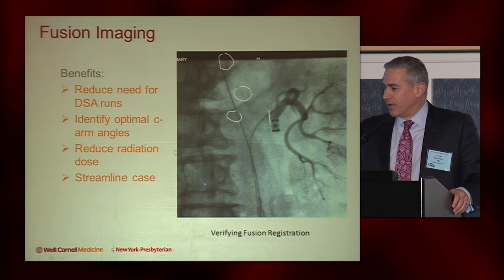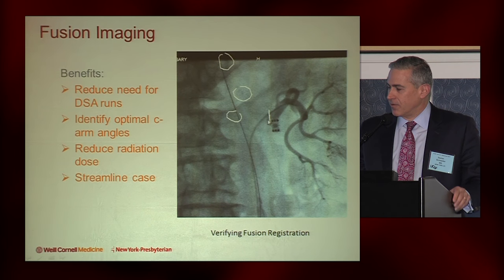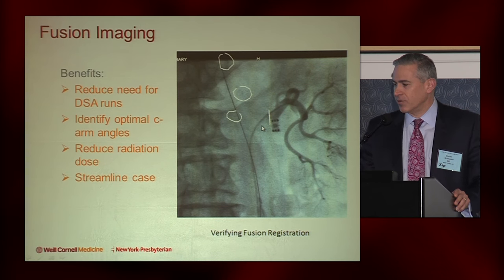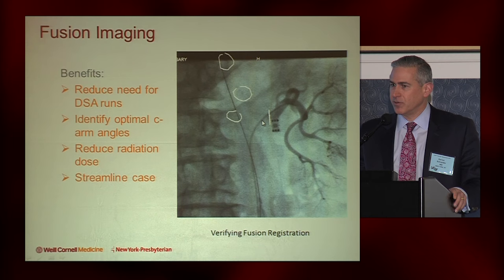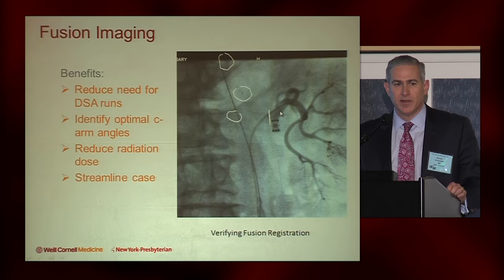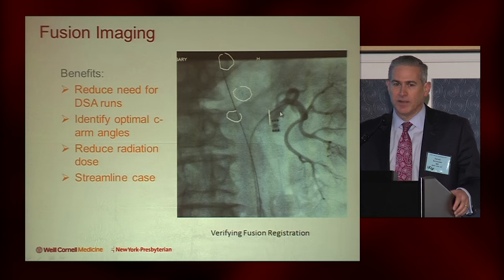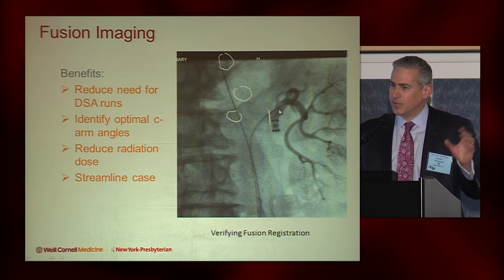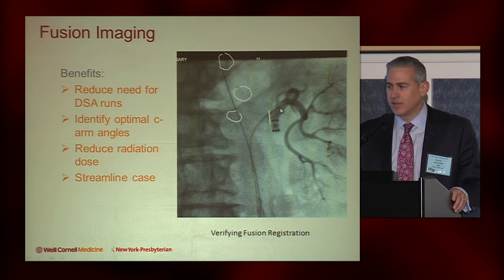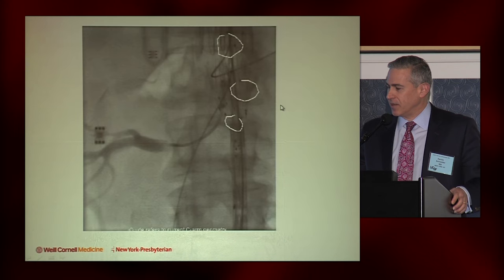Here is one of our cases — a complex thoracoabdominal case. Once we've created this overlay, you can see these little rings: those are the markers for the celiac, SMA, and the two renal arteries. We usually do a quick catheterization of one or two of these vessels to confirm that our registration and alignment is appropriate. Here you can see good alignment with the target left renal artery. We don't do digital subtraction angiography to start these cases — we basically just catheterize, do a puff of contrast, and save the radiation by not doing the DSA runs.